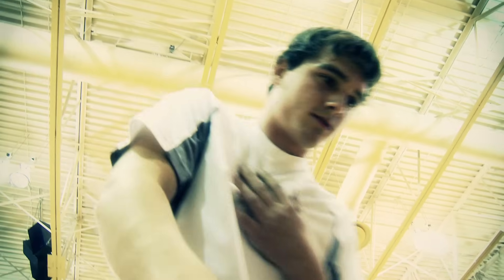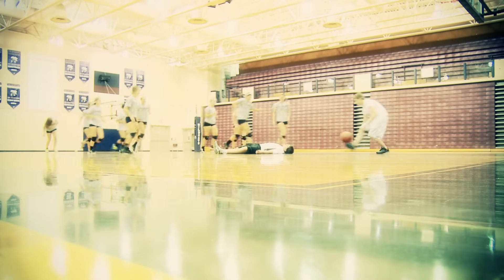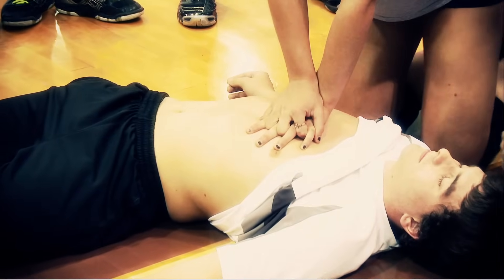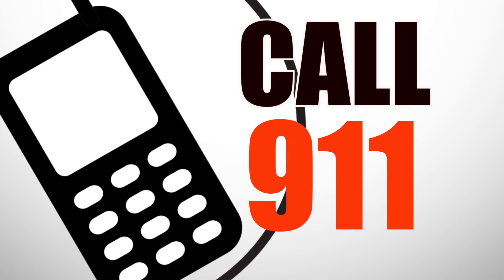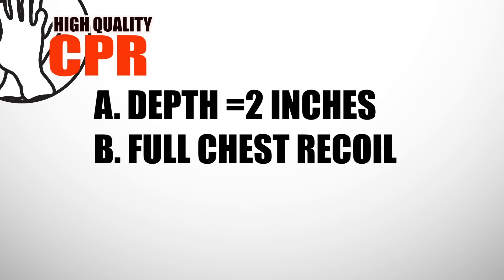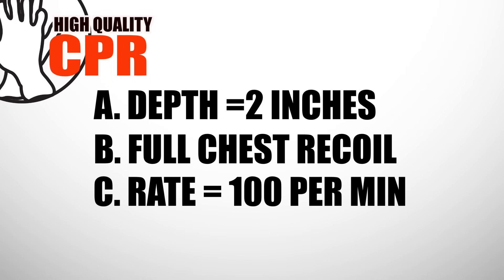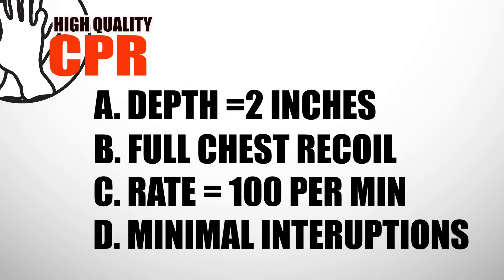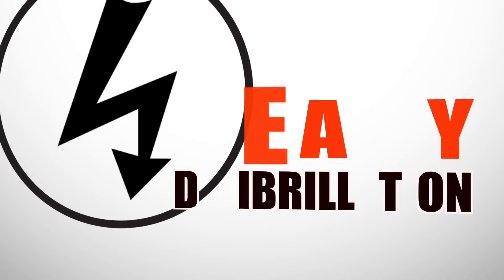Cardiac arrest can occur at any time. It is important that witnesses of cardiac arrest respond immediately and without delay, as any unnecessary delay decreases a victim's chance for survival. Remember the key components to a successful resuscitation: one, early activation of the emergency response system — 9-1-1; two, high-quality CPR: depth of two inches, full chest recoil, rate of 100 compressions per minute, and minimal interruption; three, early defibrillation.